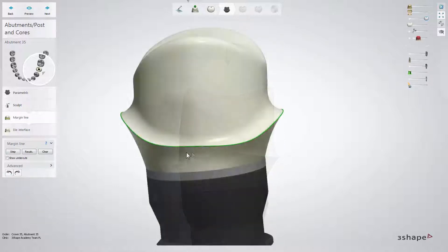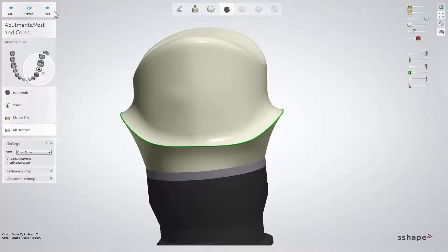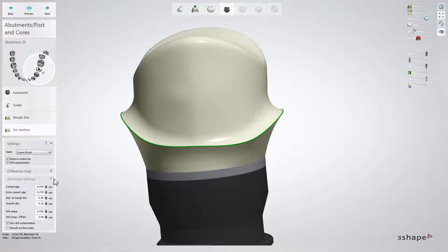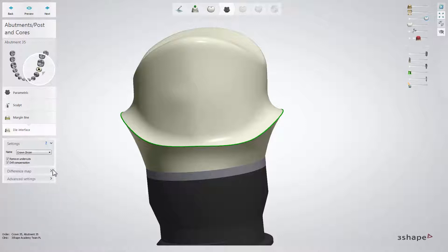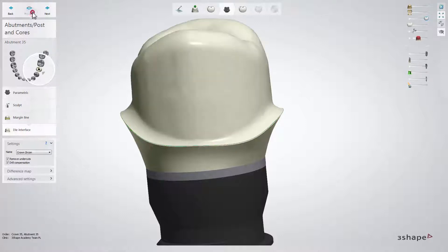Click Next to enter the margin line sub-step. In this step, it is possible to adjust the margin line for the crown on the abutment if necessary. Then click Next once again to get to the die interface and its advanced settings, where you can modify it if necessary. Click Preview to see your die interface design.